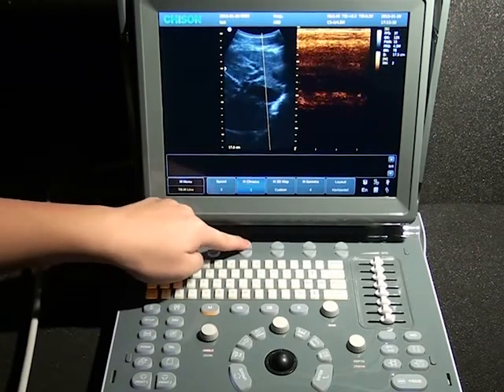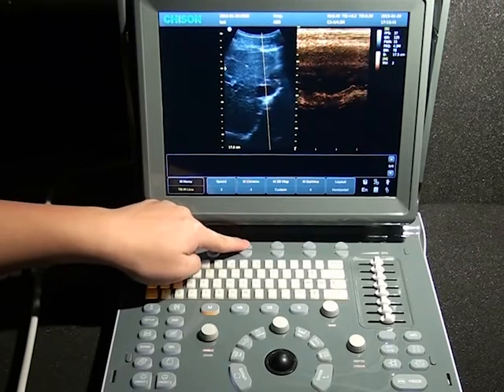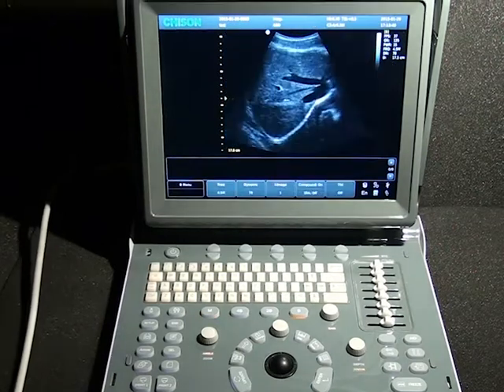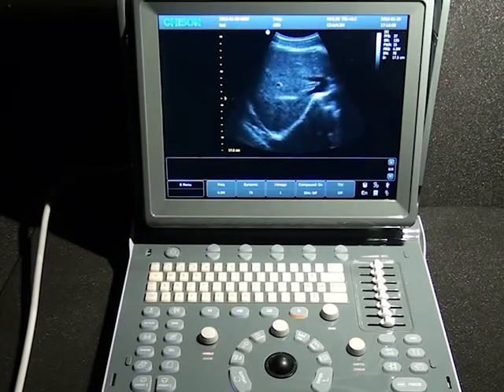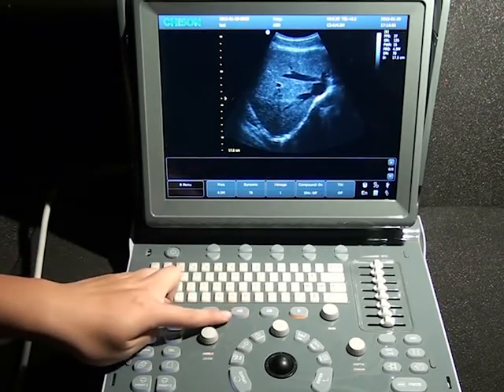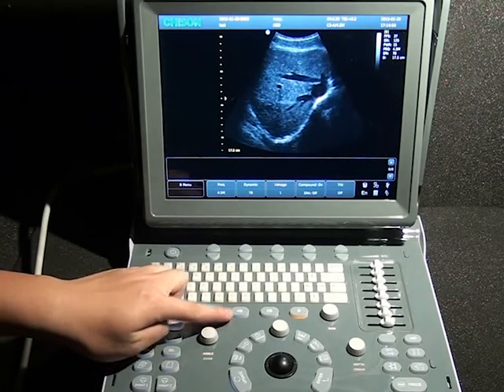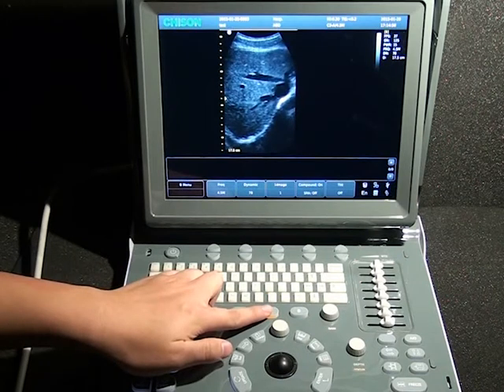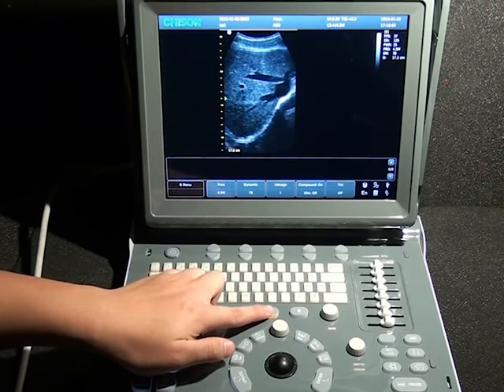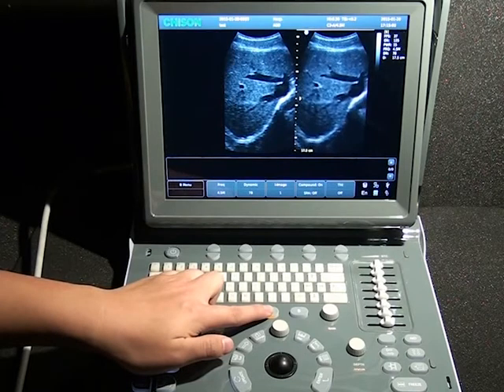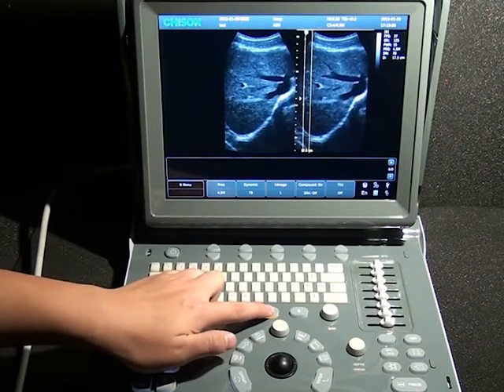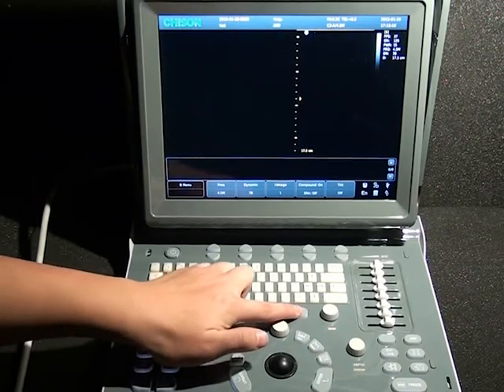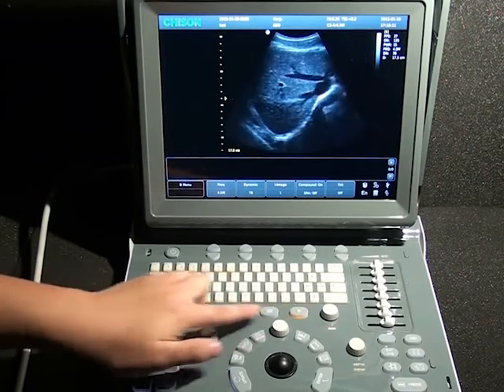Besides, there are eight types in M-mode chroma, which certainly satisfies your needs. Worth mentioning is that we have 2B mode and 4B mode. For example, 2B mode with dual screen — click for the first and get one active, push again and the next becomes active. Back and forth allows you to switch between them. Push the B-mode key to go back to single B-mode; the same works for the quad screen.